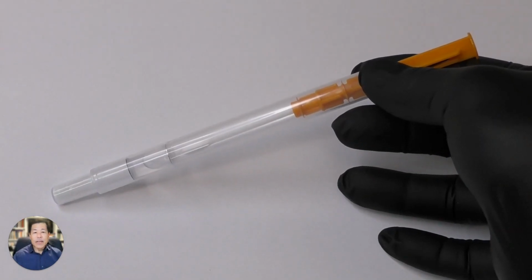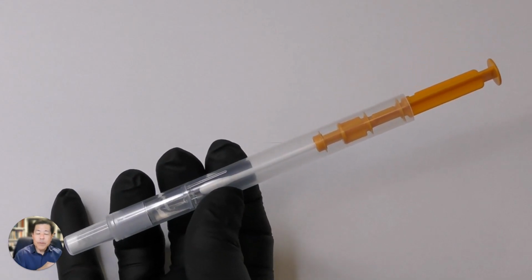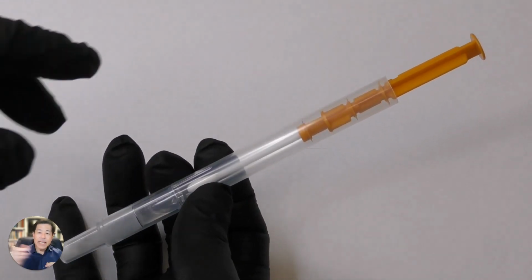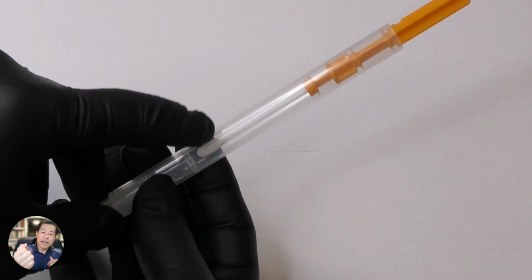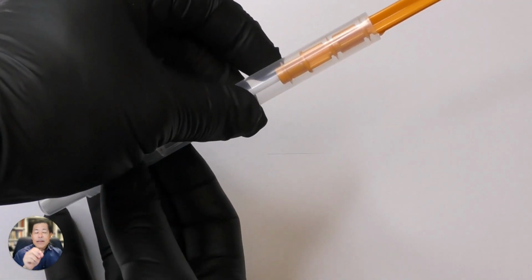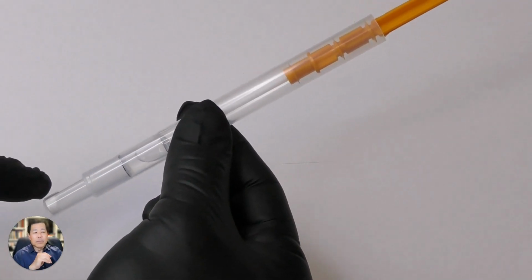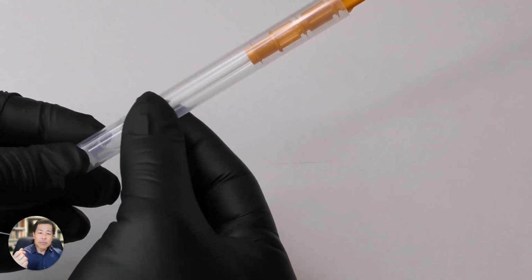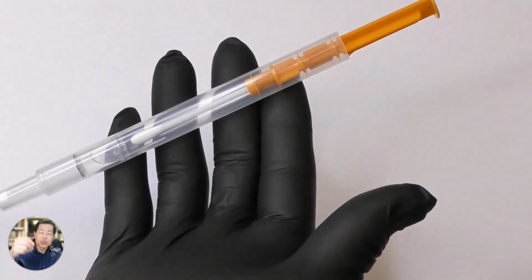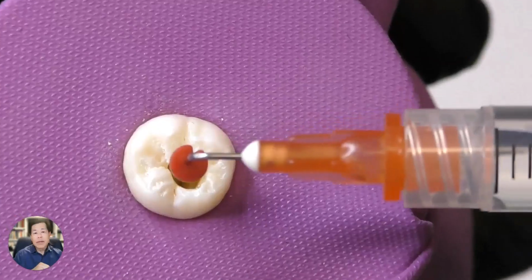So we have the Endocator, and this is the vial. Some parts of the vial: we have the swab stick, which is the orange part, and then we have the cotton swab attached to the bottom of that swab stick. The swab stick we can actually push down and it'll go into the little tube. In the tube, we have a releasing reagent, and then we have our luminescent reagent at the very bottom. So what we do is we fill the tube up with our sample. We soak some of that sample into our swab, and we press the swab into the releasing agent and mix it with our luminescent reagent.